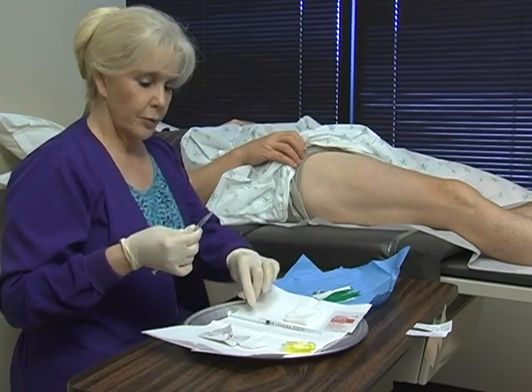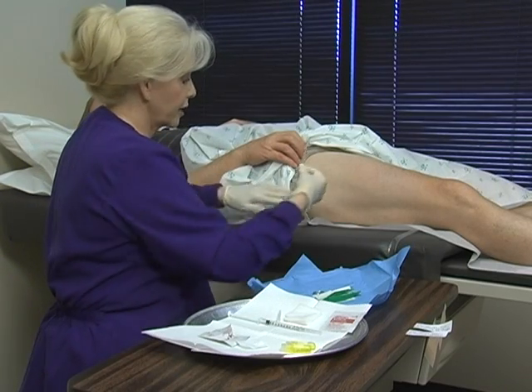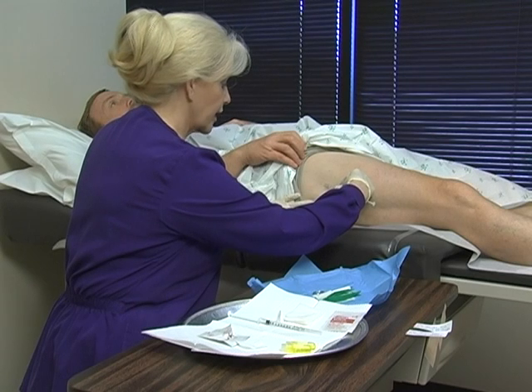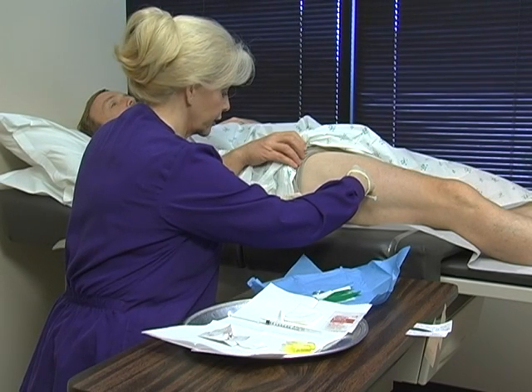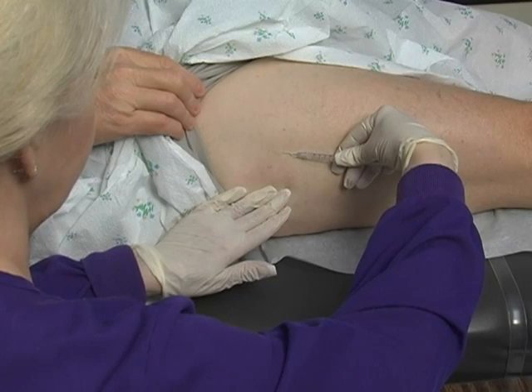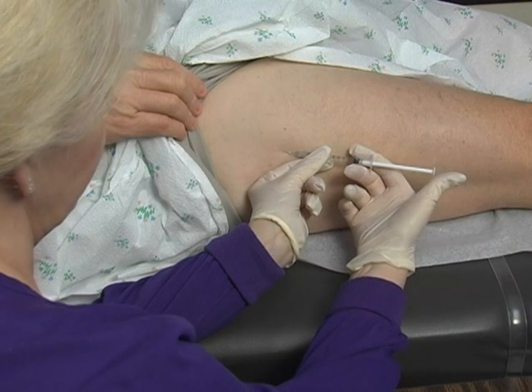I always inform our patients that the lidocaine can sting, and sometimes just distracting them by having them take a deep breath helps. Here's your initial stick — take a deep breath, Bob, inhale and then exhale. And a little bit bigger sting right now.